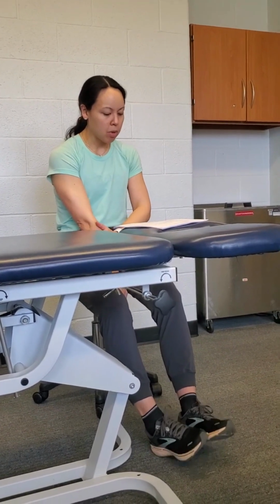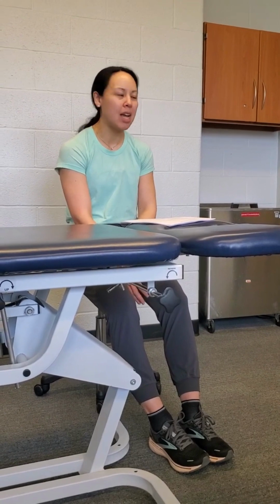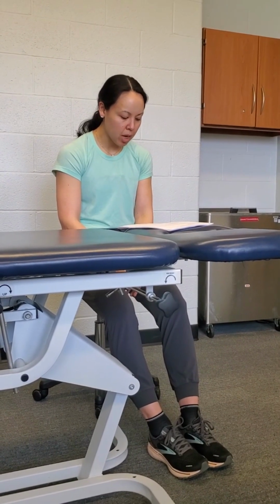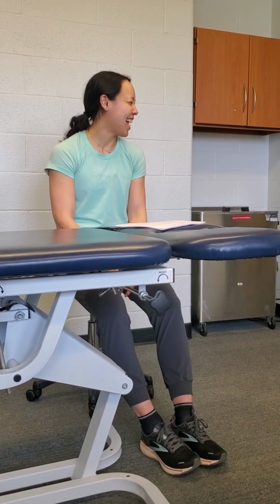To improve vascularity of a joint, the limb occlusion pressure is typically higher at about 80%, and that's if you're using it for pain modulation on that patient who's post-op day 3 and they're really struggling with a lot of pain and they're just not tolerating any exercise. That's when you do more of the passive BFR and you're just trying to help modulate their pain, get some blood flow and that type of thing. Machine exercises are typically best. So it's a great way to do it more objectively too, and track how much load you're using.